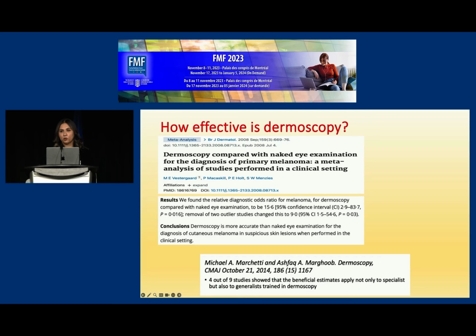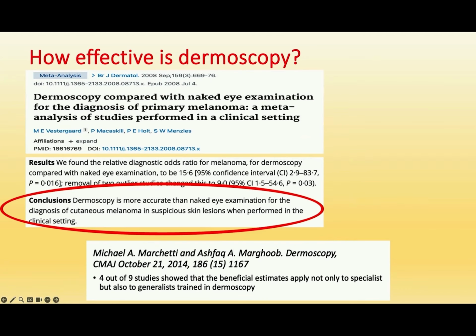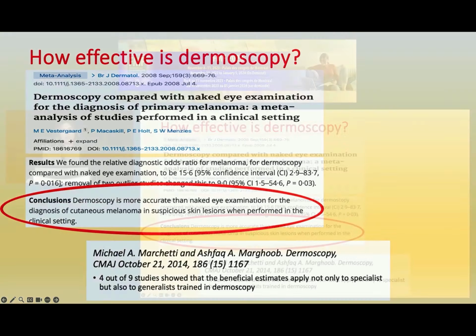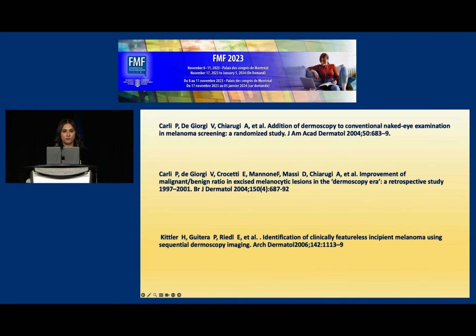So that's your polarized and non-polarized dermoscopy. Then the next question is, is it worth it? Does dermoscopy work? In this meta-analysis from 2008, the authors concluded that dermoscopy is more accurate than naked eye examination for the diagnosis of cutaneous melanoma in suspicious skin lesions when performed in the clinical setting. And Marchetti and Marghoob further sub-analyzed the data to show that the benefits apply not just to specialists, but also to generalists trained in dermoscopy. So it's worth our while to do so.